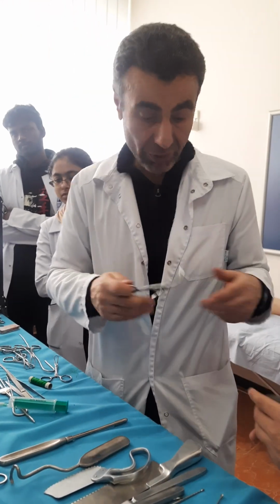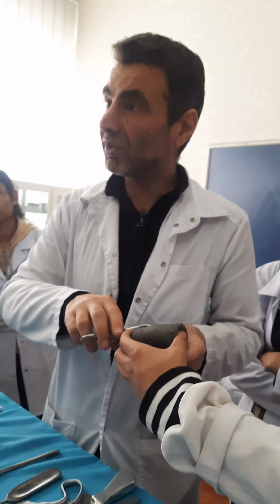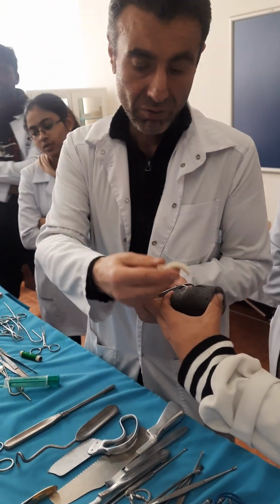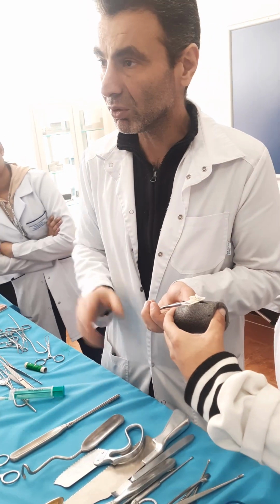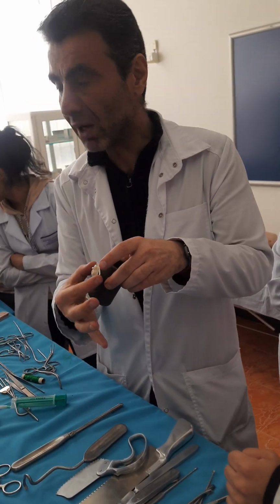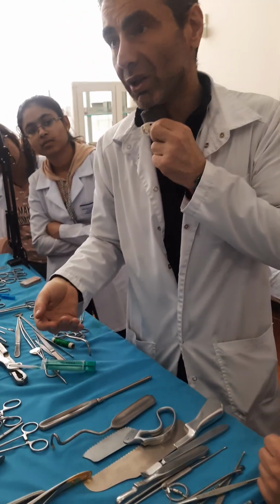What after? After that you take this instrument, we call it the retractor of Trousseau. In a closed way, you insert it inside the aperture, you enlarge it, then you take your last instrument, which is called the tracheostomy tube. Firstly, you put it in this horizontal plane, then you turn it to the vertical to not damage the posterior wall again. And now, after this, you remove your Trousseau, you suture the wound up to this instrument, and by these apertures, you fix it by bandages on the neck to prevent any dislocation.